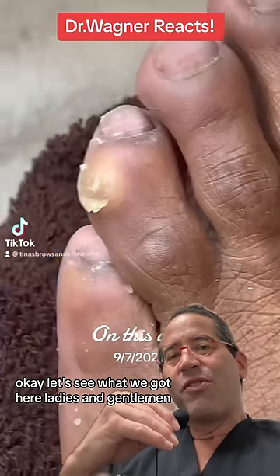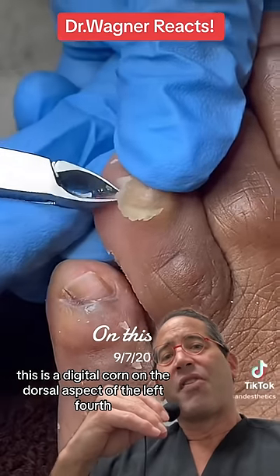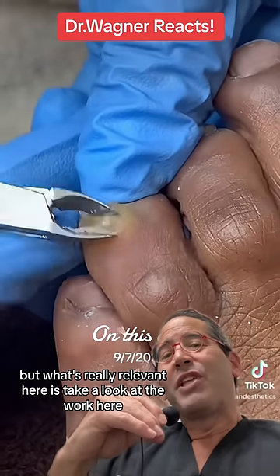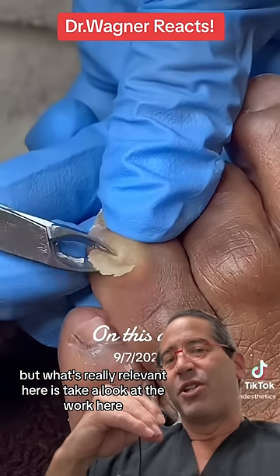Okay, let's see what we got here. Ladies and gentlemen, this is a digital corn on the dorsal aspect of the left fourth toe. These are extremely common, but what's really relevant here is take a look at the work here.